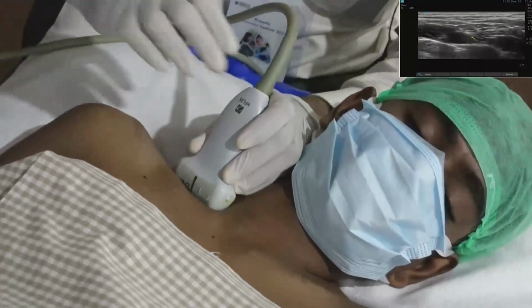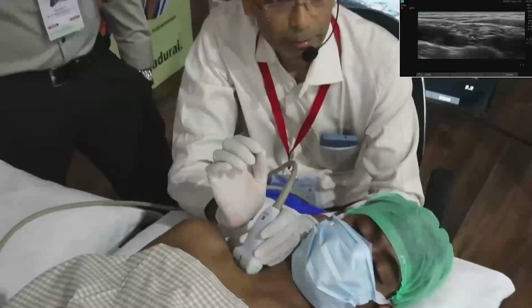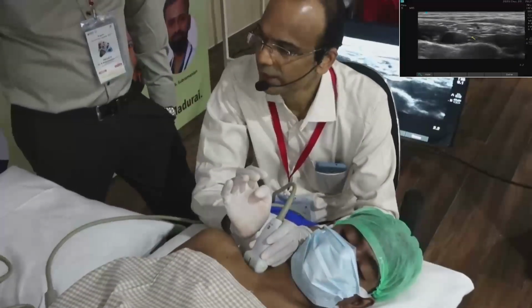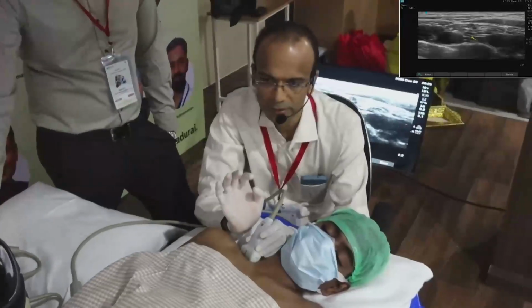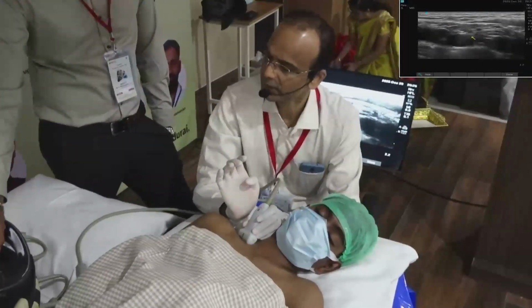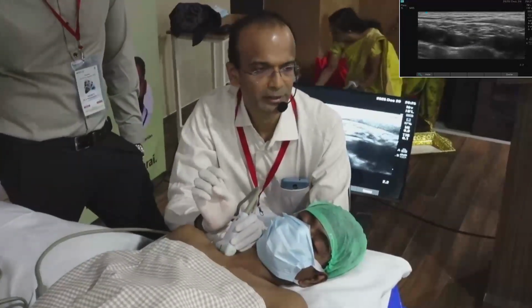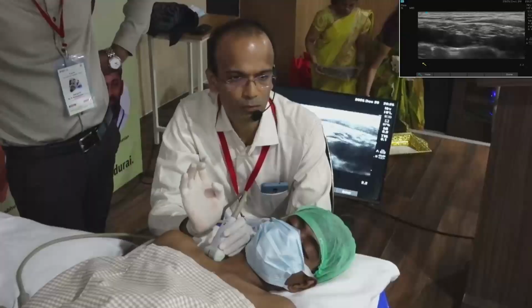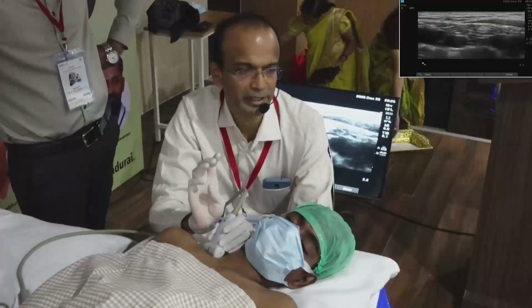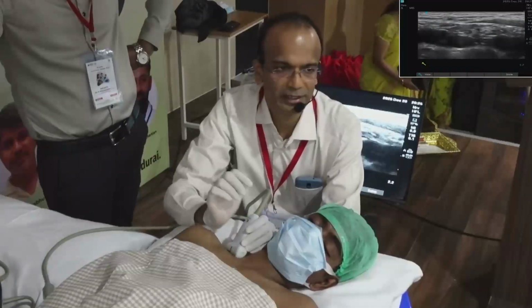Why is the corner pocket important? In the initial ages of ultrasound, or in PNS, people used to give a combined supraclavicular block and axillary block. Even now, sometimes people don't want to miss any component, so they simply give supraclavicular and axillary.